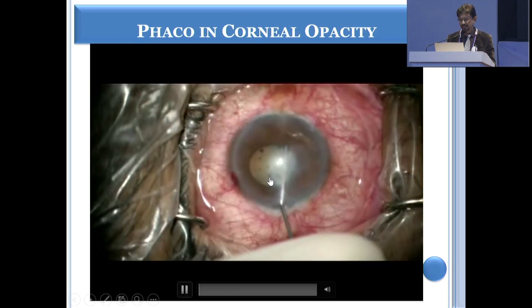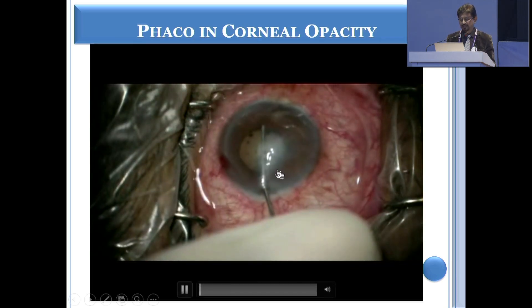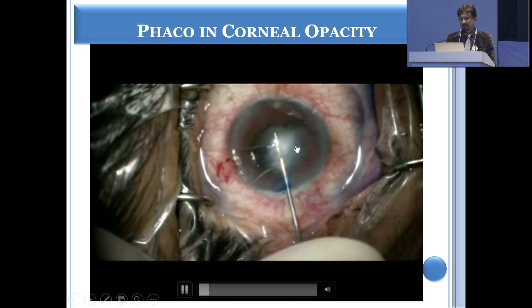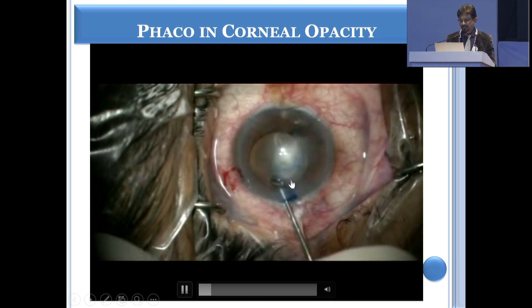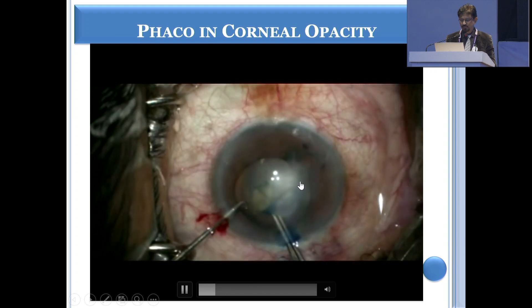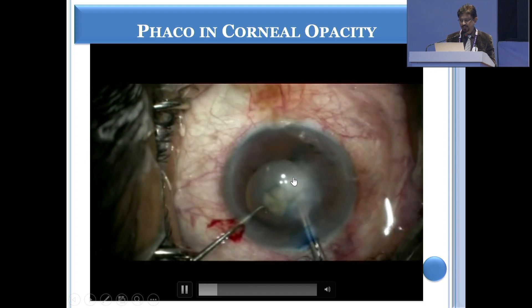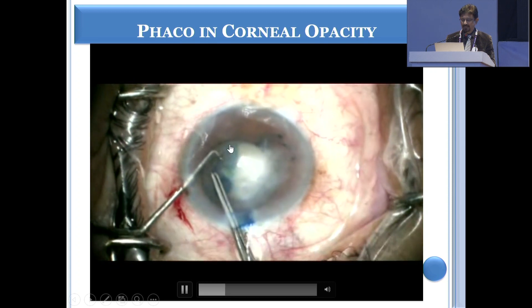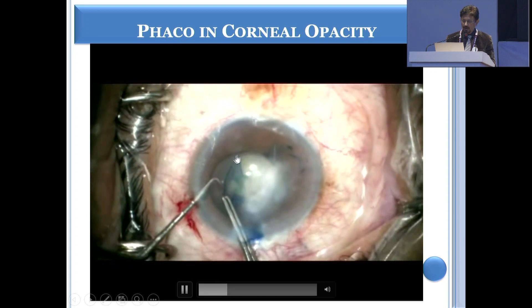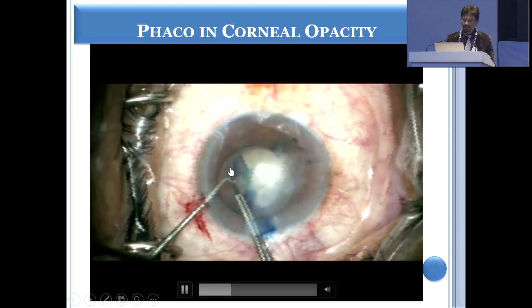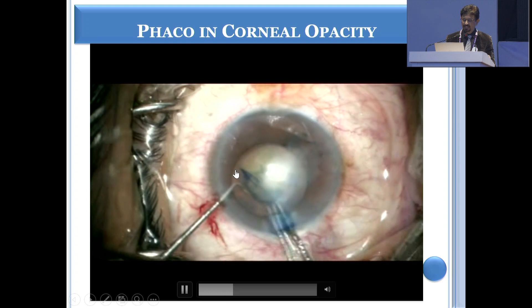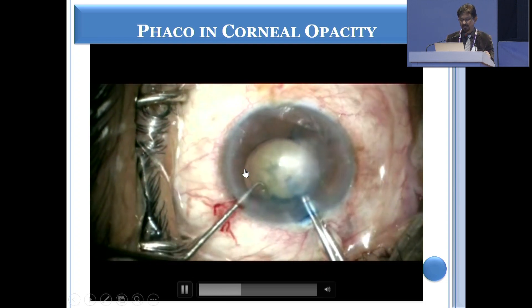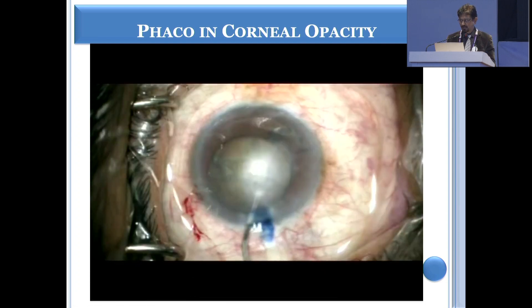Now, if you have an opacity and you are doing a capsulorrhexis, once you start the capsulorrhexis and you have held it, you don't stop behind the opacity — you stop opposite the cornea which is clear, so that you can hold the capsulorrhexis margin once again and complete it.